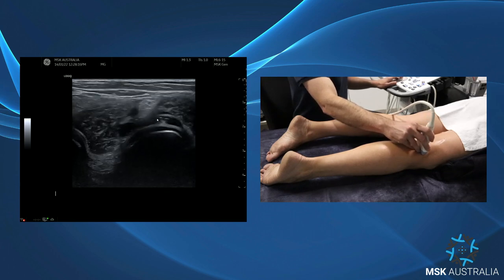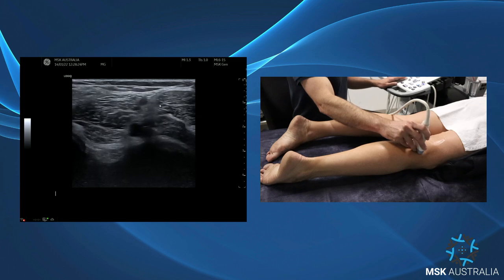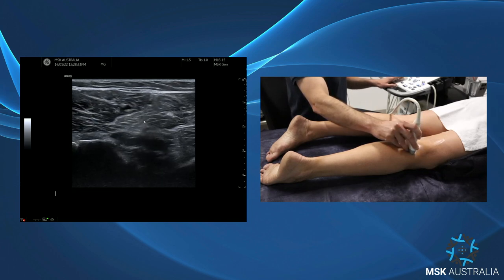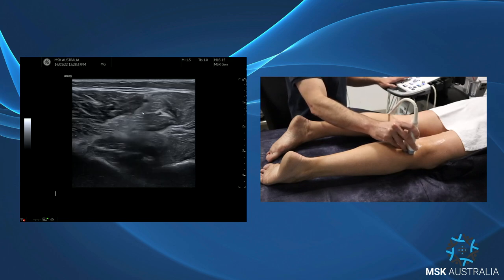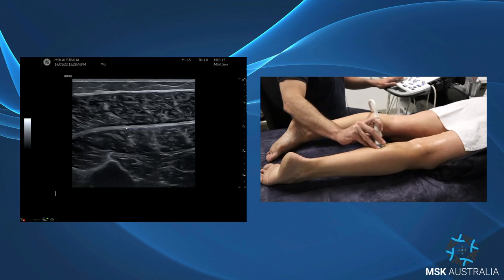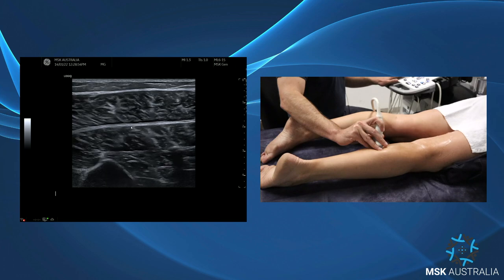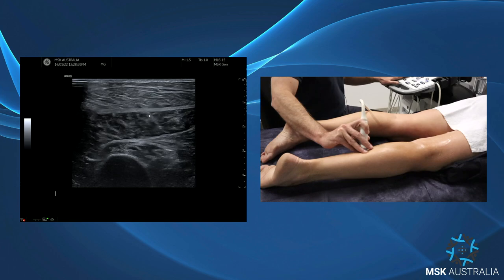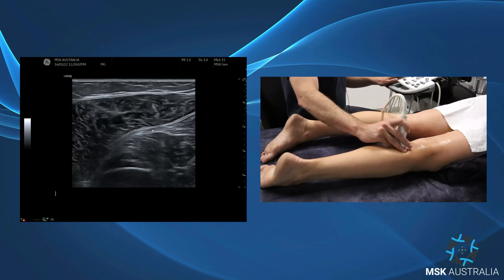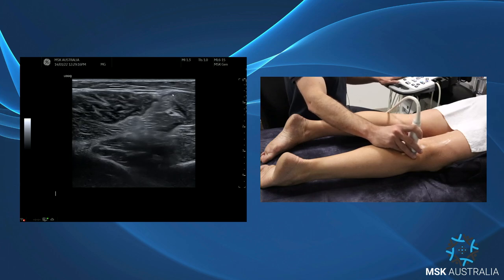This is where we'll also see our plantaris. Plantaris has its attachment just a little superior and medial to the lateral gastroc. Our model here doesn't really have a prominent plantaris to show, but it would be coming through and sliding just next to the lateral gastroc to form its tendon. If we're unsure we're seeing a muscle, we come down to the middle of the medial gastroc and look for a little UFO-like tendon sitting in this fascial layer. Following that down, we'll see it gliding toward the Achilles, and following up we'll see it form its musculotendinous junction usually around the level of the soleal sling, then the muscle coming up and around the lateral gastroc to insert high.